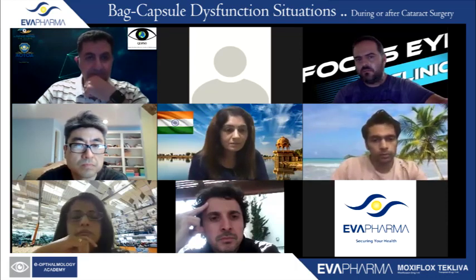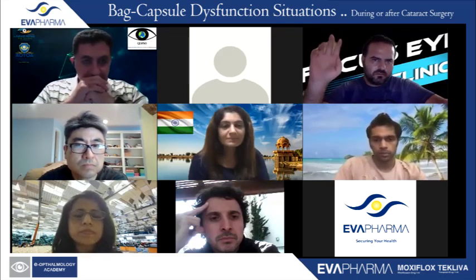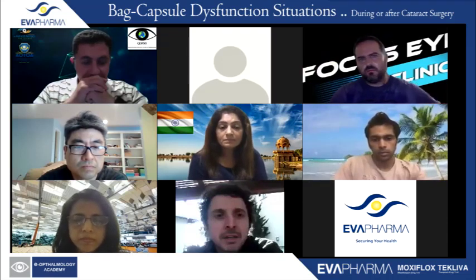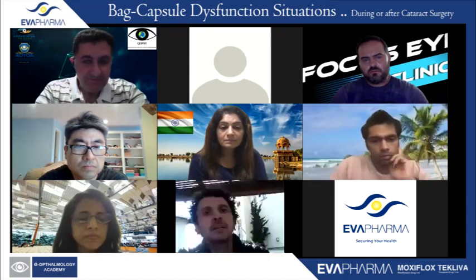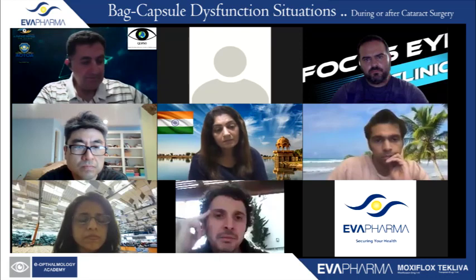Sergio, what do you feel? I thought a large PCR, I prefer posterior vitrectomy, and in part you can do anterior vitrectomy with a new incision. I agree with Priya.